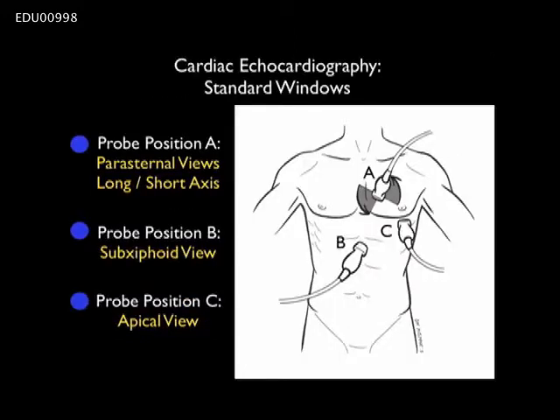For the evaluation of the pump, we're going to utilize the three main cardiac windows. Probe position A is the parasternal window, with two main views: the parasternal long and short axis views. We can move the probe further inferiorly to the subxiphoid position as probe position B, seeing the heart from a more inferior aspect. We can then move the probe more laterally to probe position C, the apical window, offering several views from a more lateral orientation.